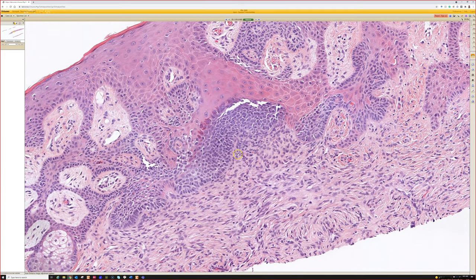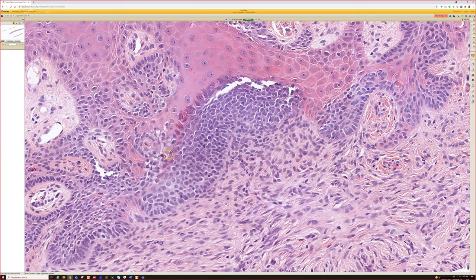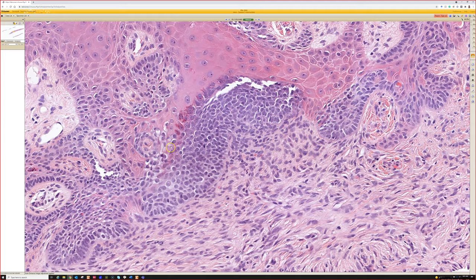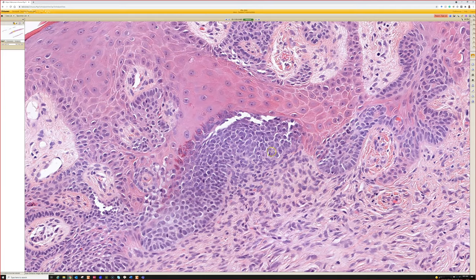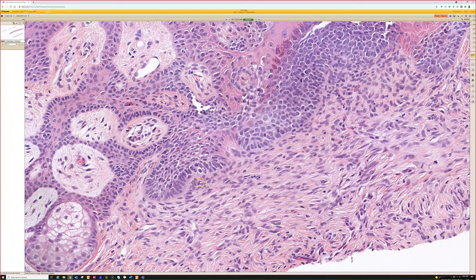This one's nice because it's even got those little bright red trichohyalin granules to show you this really is an immature hair follicle growing here. That can help you know that's the same thing happening here. I find that the stroma pushing right up against it and hugging it without that mucin-filled space is a really helpful feature.